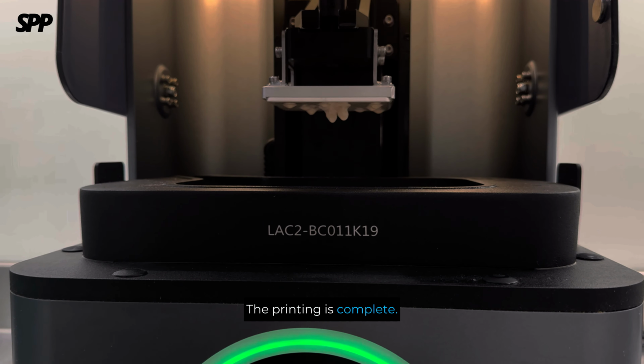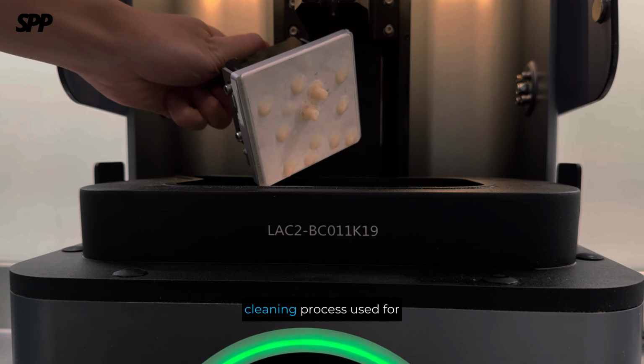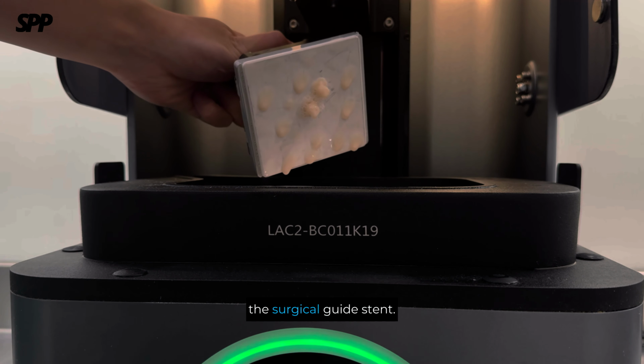The printing is complete. After removing the crowns from the build plate, I followed the same cleaning process used for the surgical guide stent. Since the implant diagnosis, planning, surgical guide, and crown were completed, I proceeded with the surgery. The tooth was extracted first. I reviewed the report beforehand. Still, during surgery, it is a good idea to keep it next to you so you can check it any time. One important point when using a surgical guide stent is this.